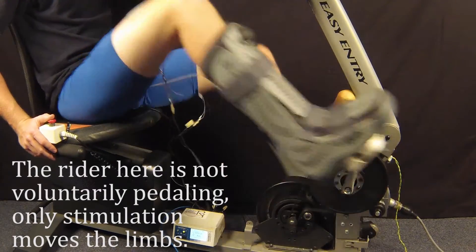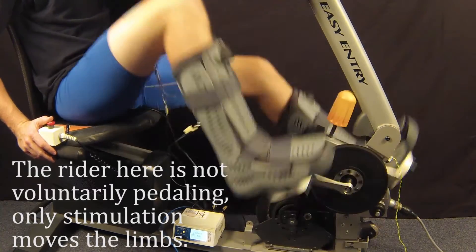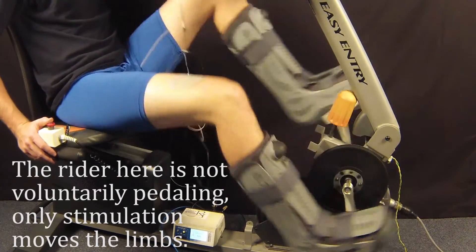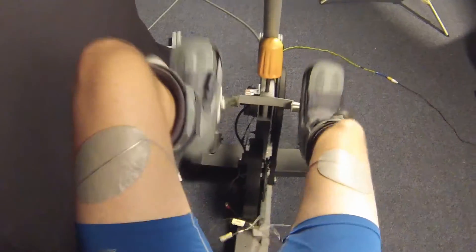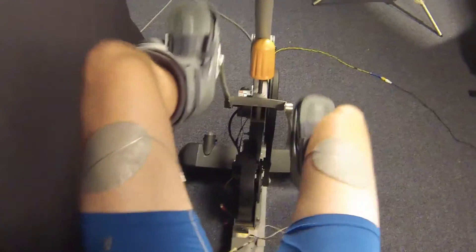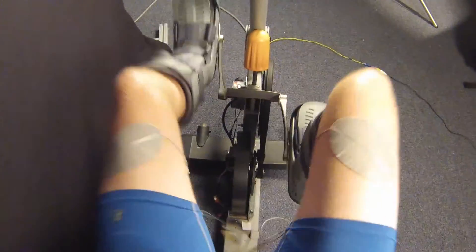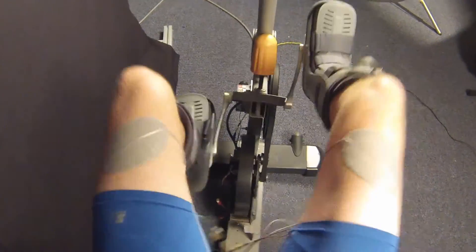The challenge here is that during dwell times when some muscles are not being stimulated, the error system exhibits unbounded growth. Our group has developed conditions to ensure robustness and stability during electrical stimulation cycling, including how and when to switch between the specific muscle groups.